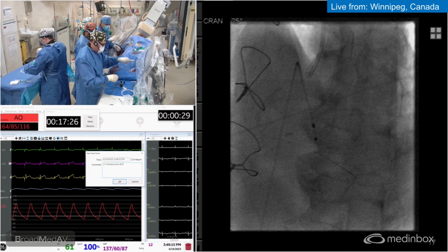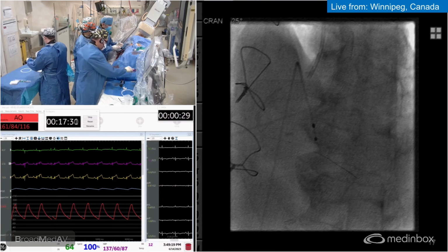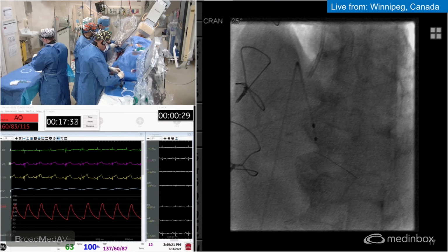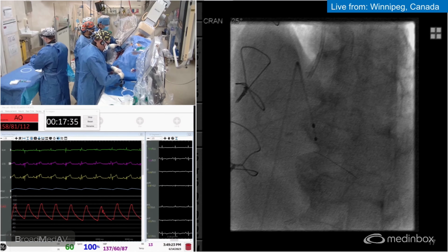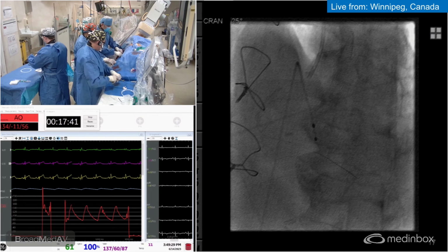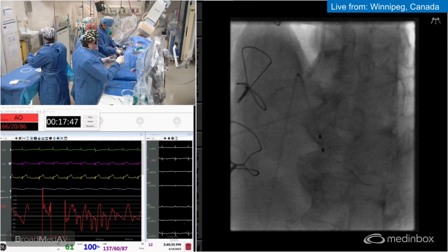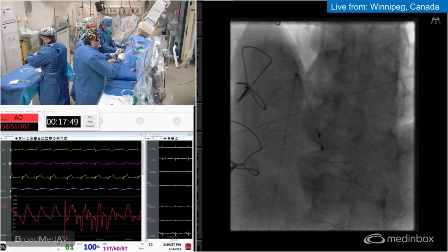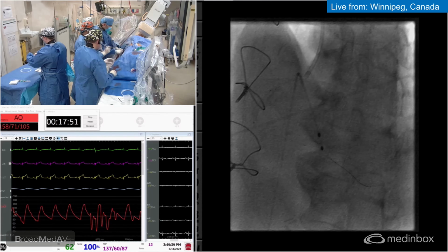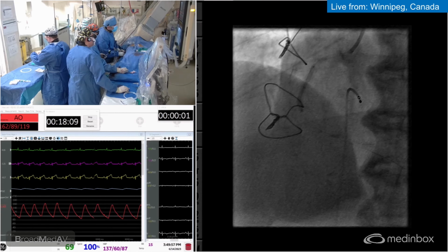Now that we've confirmed with the OCT that the vessel is large enough, we're going to see if that was enough by taking an NC balloon down, or if we still need more modification. I like your choice of longer NC balloon, because if you have a shorter NC balloon and you're within a large diffuse segment of calcium, you get a false sense of expansion. This way you'll realize how far you're in and get a good sense of whether the balloon is actually expanding. We're at 20. It's not rupturing.